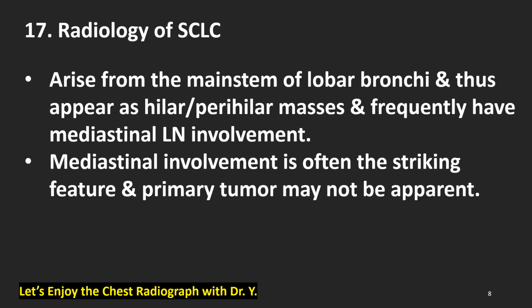Radiology of small cell lung cancer. Small cell lung cancer arises from the main stem or lobar bronchi and thus appears as hilar, perihilar masses, and frequently has mediastinal lymph node involvement. Mediastinal involvement is often the striking feature, and the primary tumor may not be apparent.